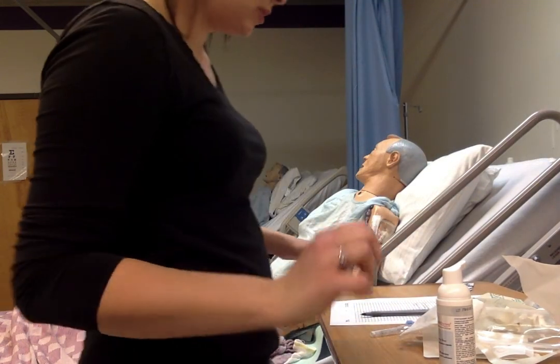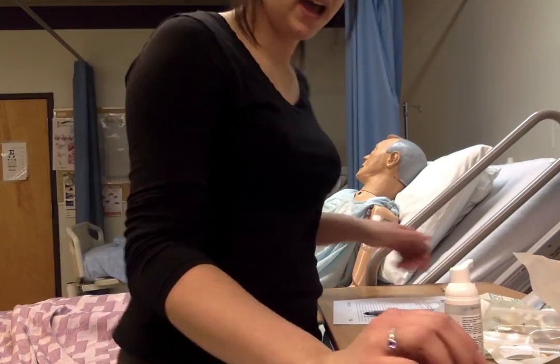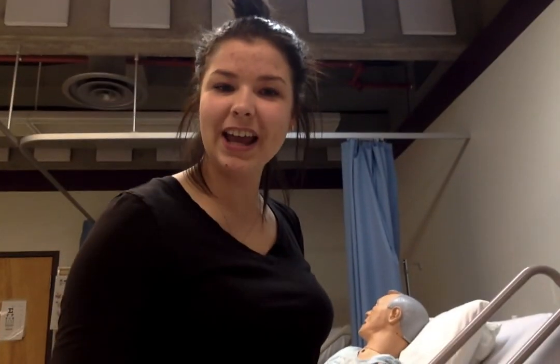All right, so that is good to go. And then somebody else will be coming in and doing the dose.